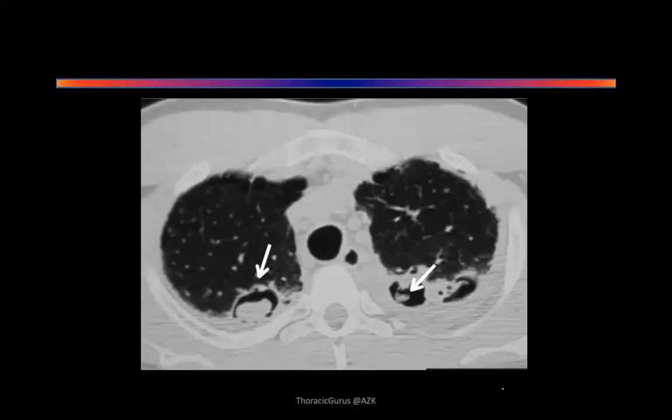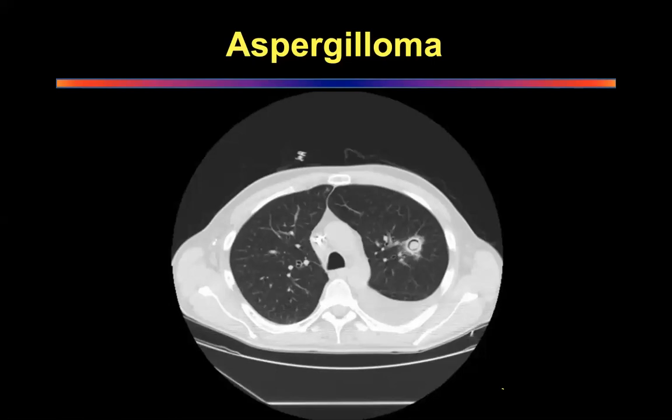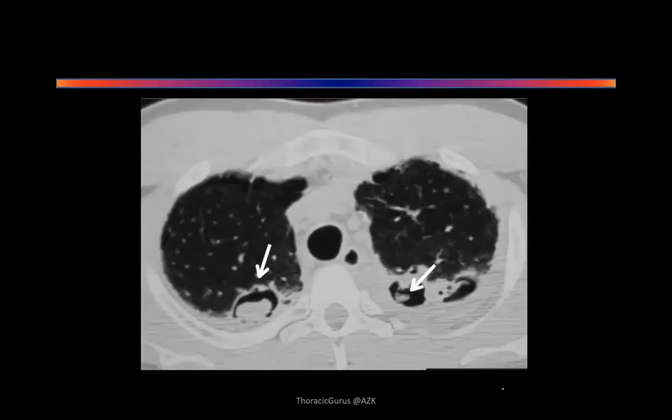Well done. Okay, and I like that you've picked up the pleural effusion, because very often people only look at that cavity and they forget the pleural effusion. Okay? All right. Somebody else, quickly come in. Who is there? Vikas is there. Vikas, come in. Ramaswamy.